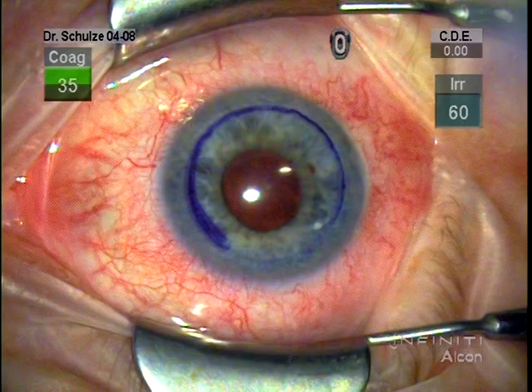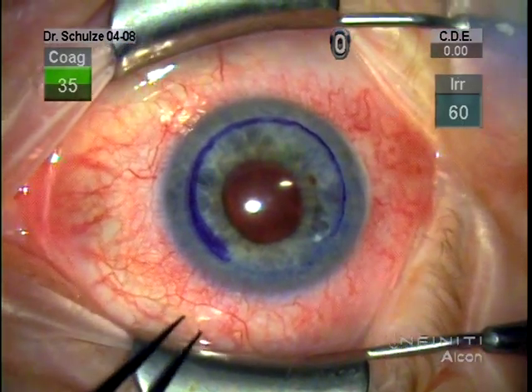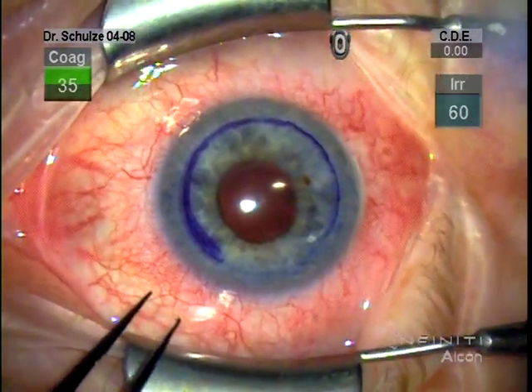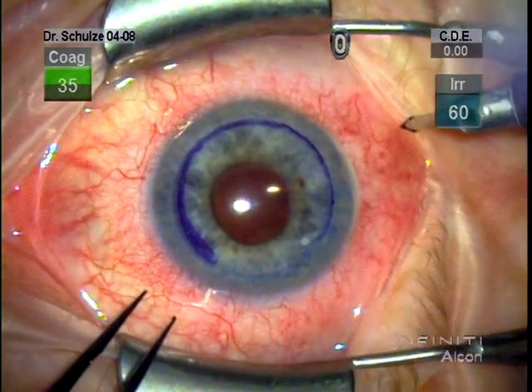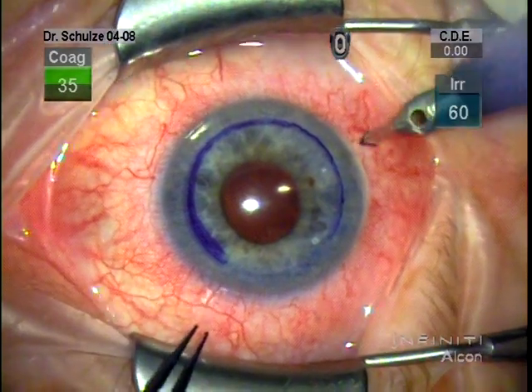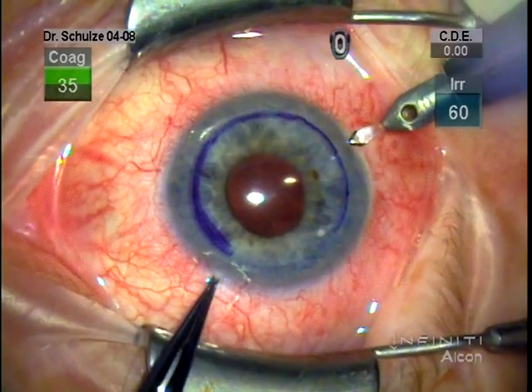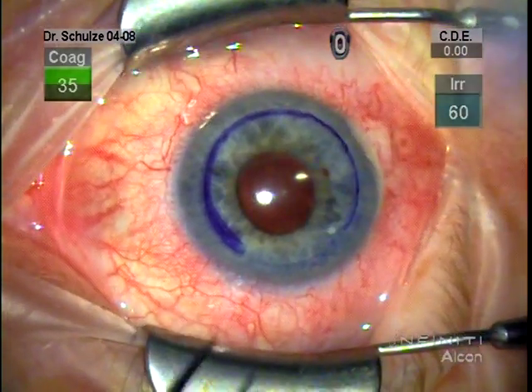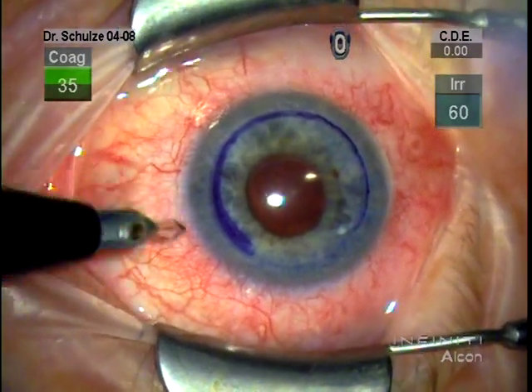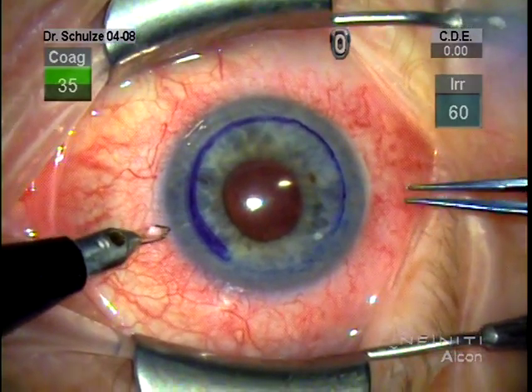Having trephined the donor, we irrigate with balanced salt and place a cover on the donor and turn our attention again to the host. In general, I like to make the incision on the steep axis of the cornea because I'm using about a five millimeter incision and hope to flatten the steep meridian whenever I can. I use either a clear corneal or a scleral tunnel incision. In this case, we're using a clear corneal incision.